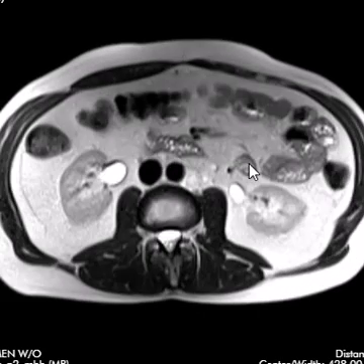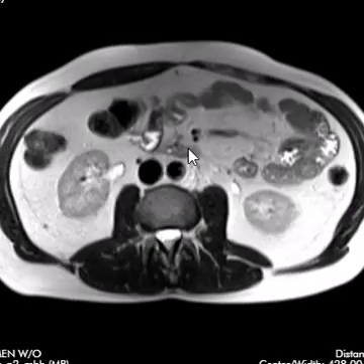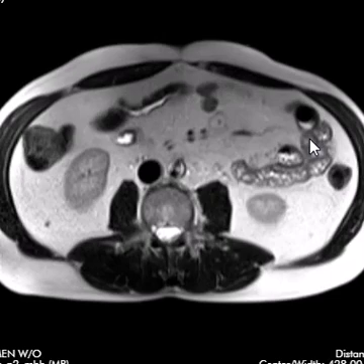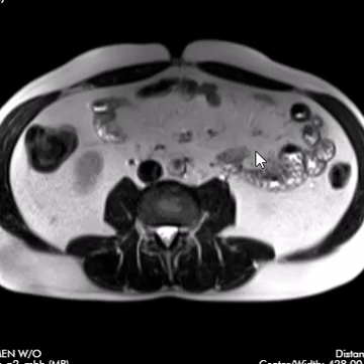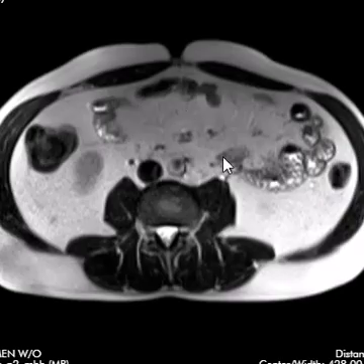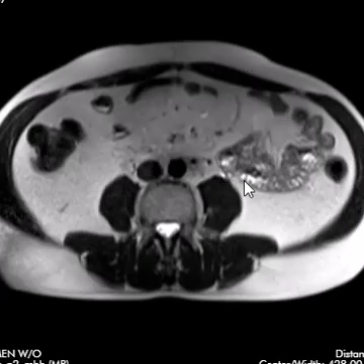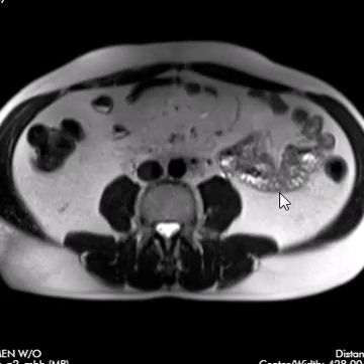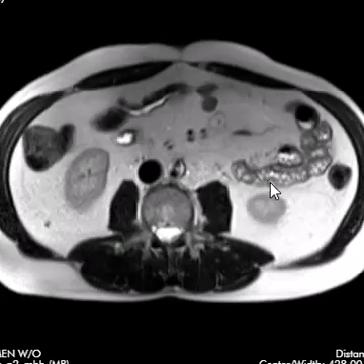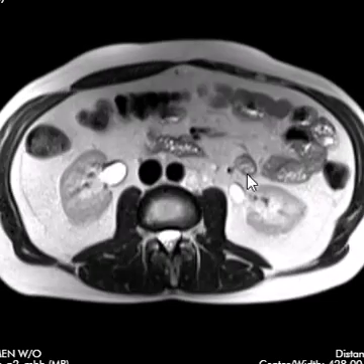Then we just keep rolling down through and make sure there are no enlarged lymph nodes. We look at all the intestines and make sure there are no dilated loops of bowel. We check the abdominal fat to make sure it's not infiltrated and there's no fluid. And that's how we read an MRI of the abdomen.